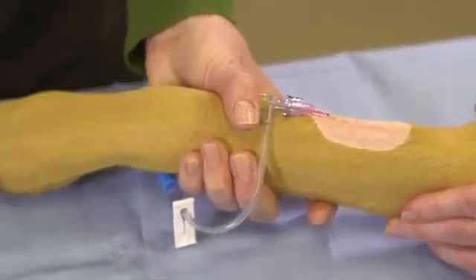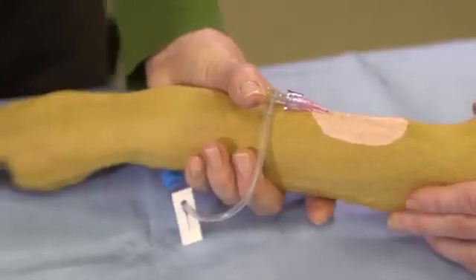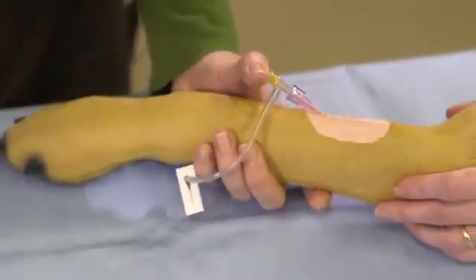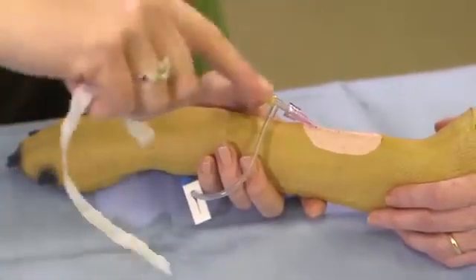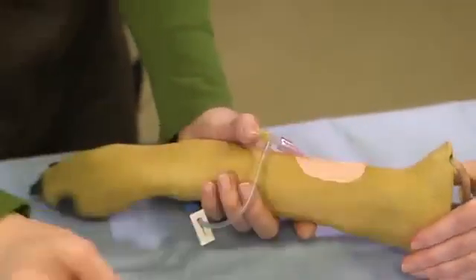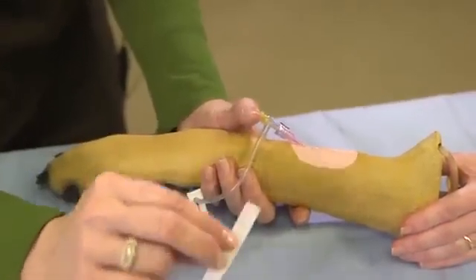Next is taping. There are many ways to tape in a catheter. I'm going to show you what I do. I take my piece of tape. You want it to be the length so that it can go around 1.5 times. I have ripped mine in half.